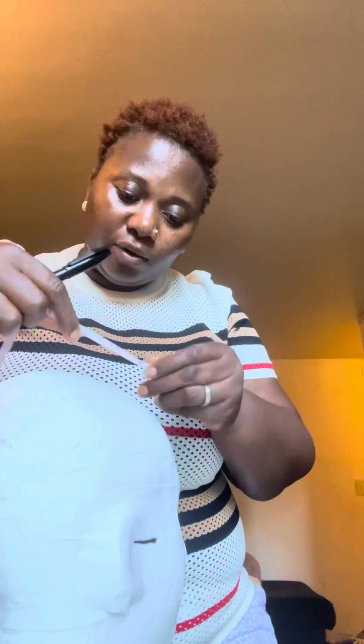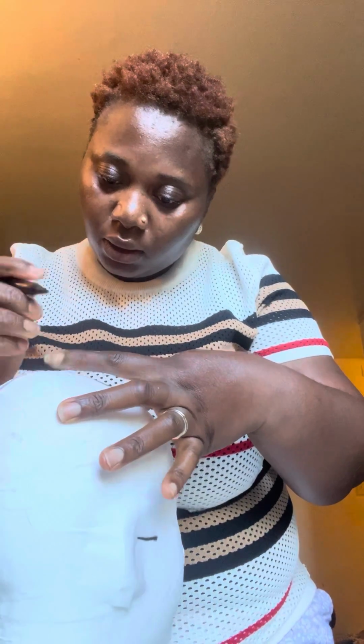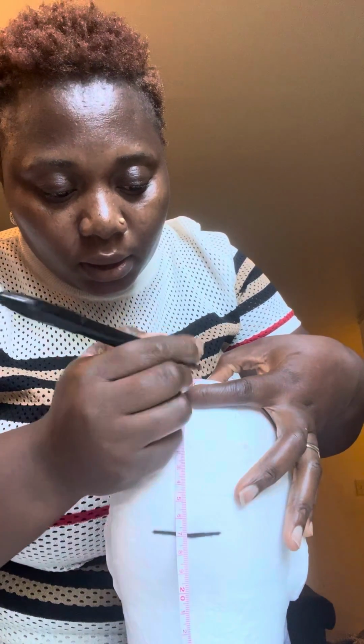FZ. So 20% from FZ to CZ, 6.6 to CZ. From CZ to PZ, 20%.